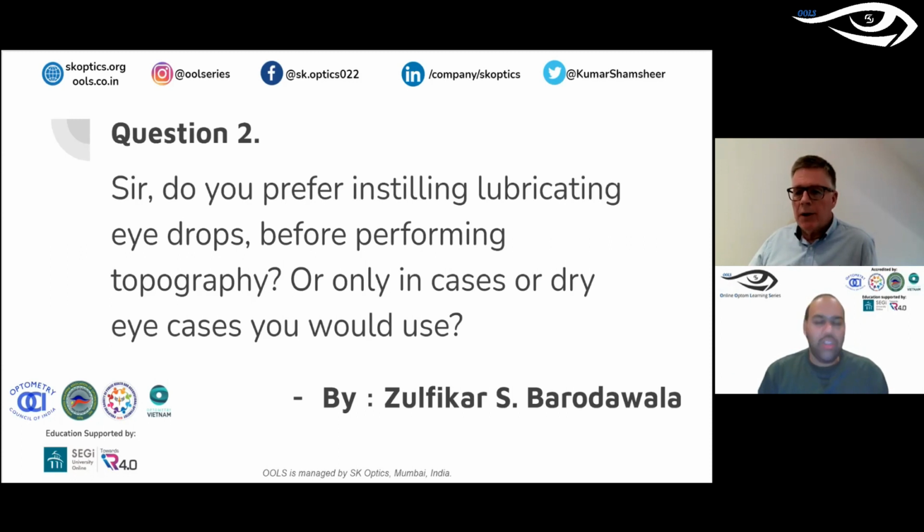No, I use hyaluronate 0.2% to just strengthen the tear film for the length of time that it takes to get an image. Now, it's quite common with the advanced keratoconus that we're getting the tear film actually running away from the apex of the cone sometimes. So it's very difficult to get an image. On a severe dry eye, you may not get an image at all, and then we'll use the drops. But that would be documented and kept in the record card itself.